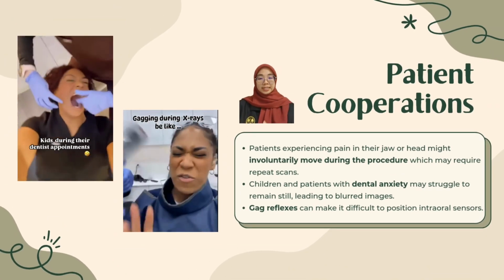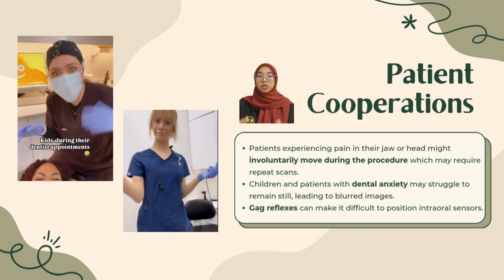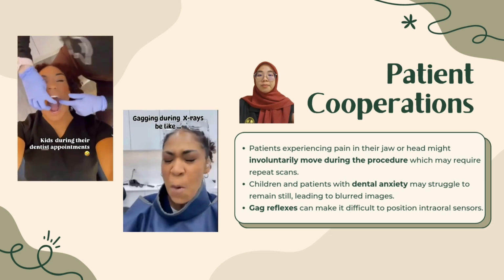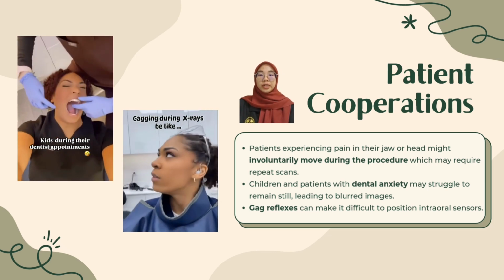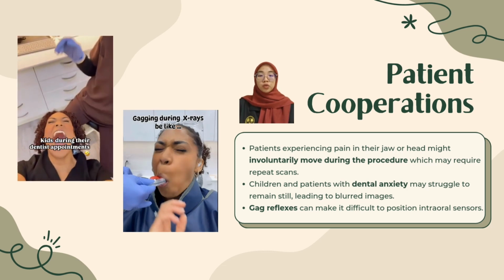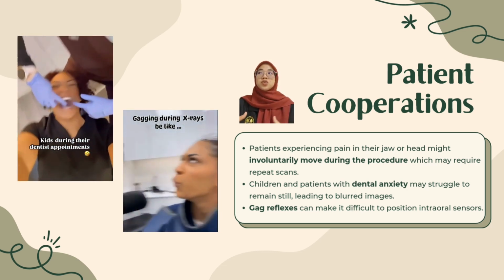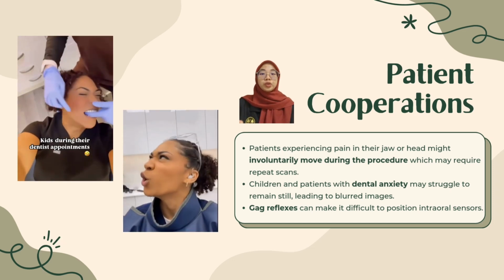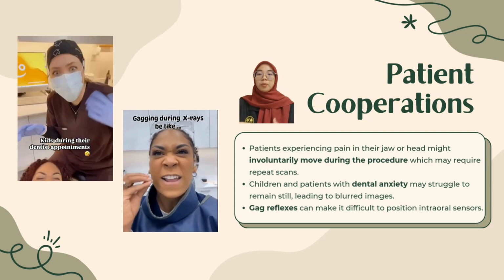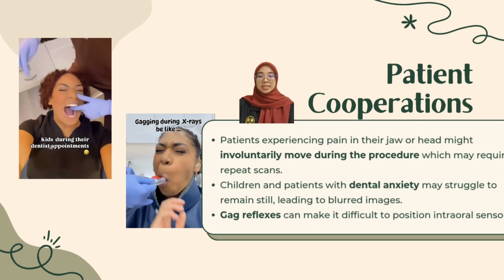Despite its advantages, dental radiography comes with some limitations. One major challenge is patient cooperation. For instance, patients experiencing pain in their jaw or head may unintentionally move during the procedure, resulting in blurred images and necessitating repeated scans. This issue is particularly common in children or patients with dental anxiety, who may struggle to remain still. Similarly, the gag reflex can make it difficult to properly position the intraoral sensor, further complicating the process.